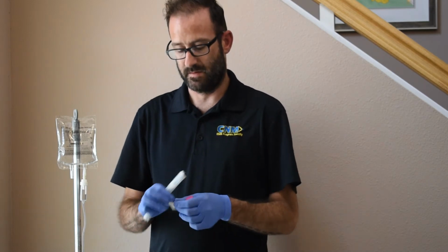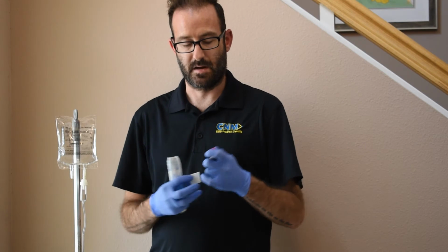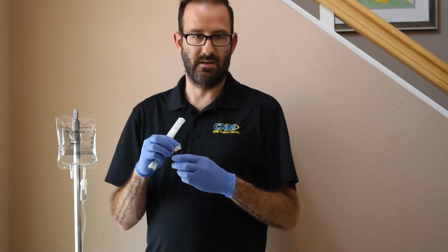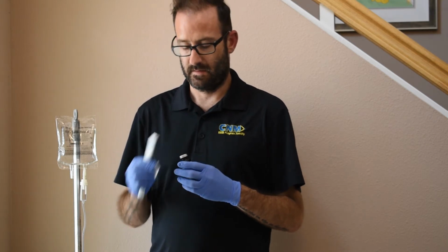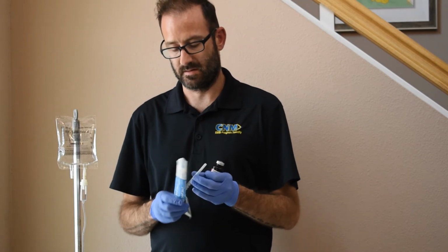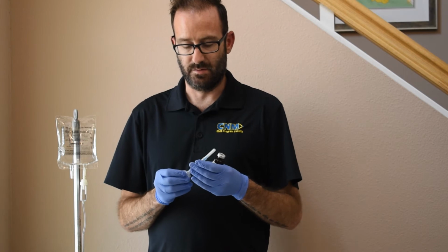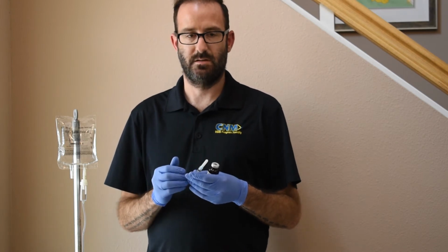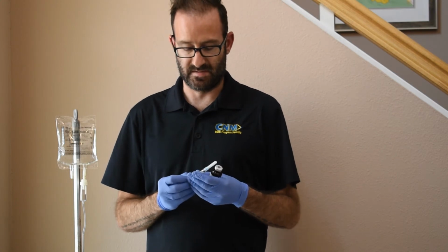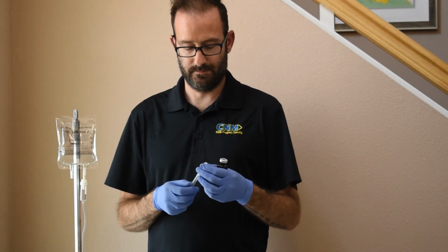The first thing that I'm going to do is go ahead and get my alcohol swab. I'm going to pop my top off of my vial. Even though it was a brand new vial, I still want to clean the top of the vial. I'm going to open my sterile syringe, remembering that I do want to draw up as much air as fluid that I'm going to get. I'm going to be using a 5 cc syringe, so I do want to draw up 3.5 cc's.